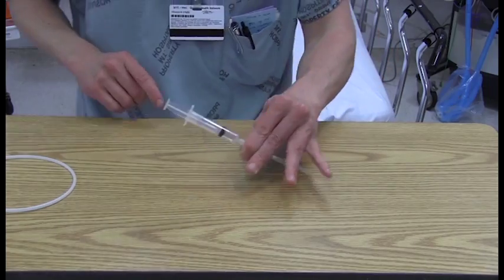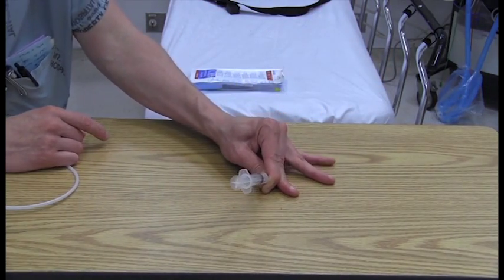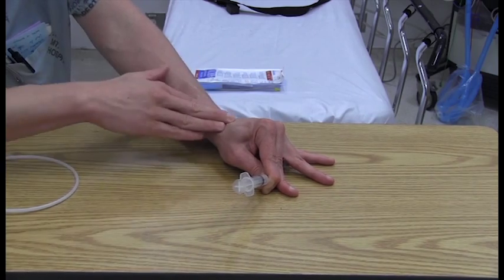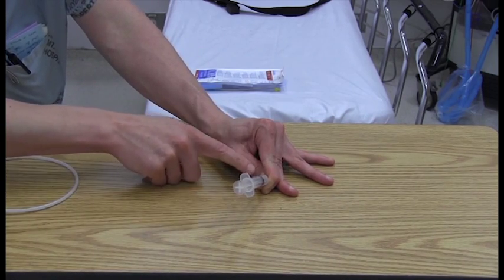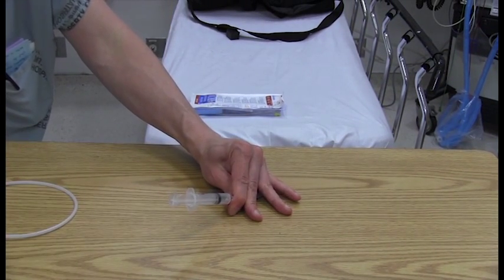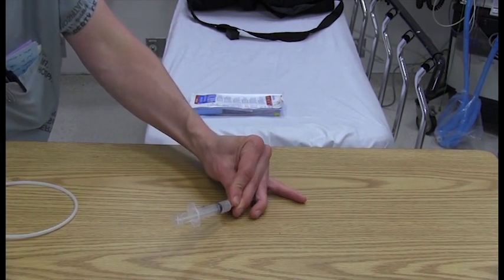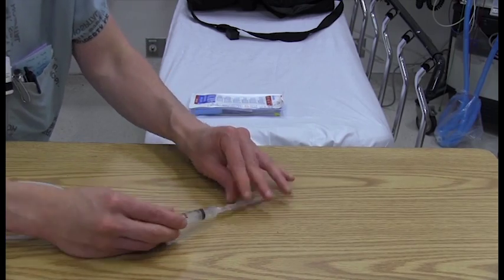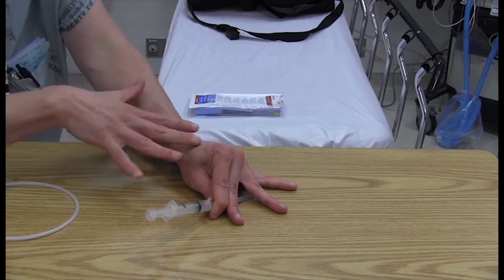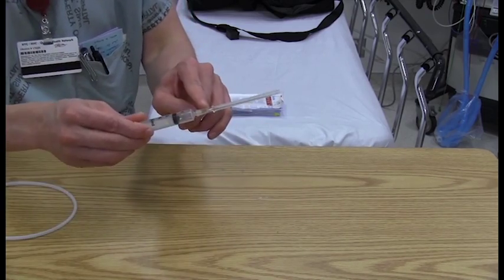I'm just going to turn so you can see what I'm doing from another angle. So spread, hypothenar eminence touching the patient, beautiful stable base, thumb and index finger at the hub of the needle. So this is what I have going. Some people will even add the middle finger to the hub. I don't like that as much, but it depends on the size of your hands. But the take-home message is a stable base and a tight holding of the hub of this needle.